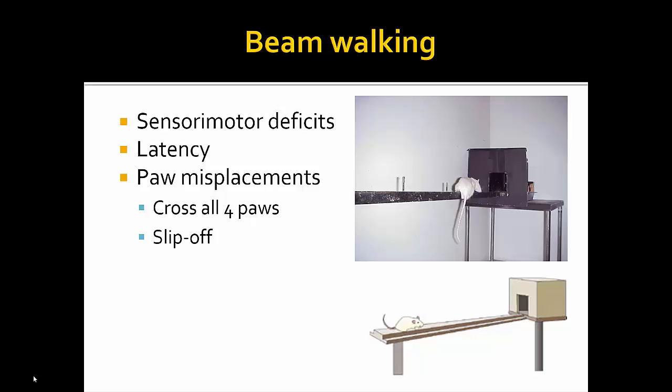But if you do this one where you make an obstacle for them so they have to balance and know where to place their feet. For the TBI animals in this study, it affected a lot of their back leg movement. So what they really did was take their front legs and pull themselves across the beam. There's a compensation change. And so at this point, our confound came: do we still count that as them actually getting through the paradigm, because they didn't use all 4 feet? That might be more of what you would need to see.